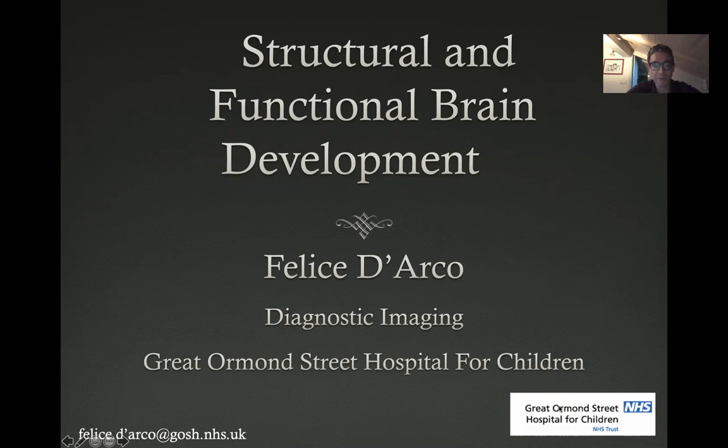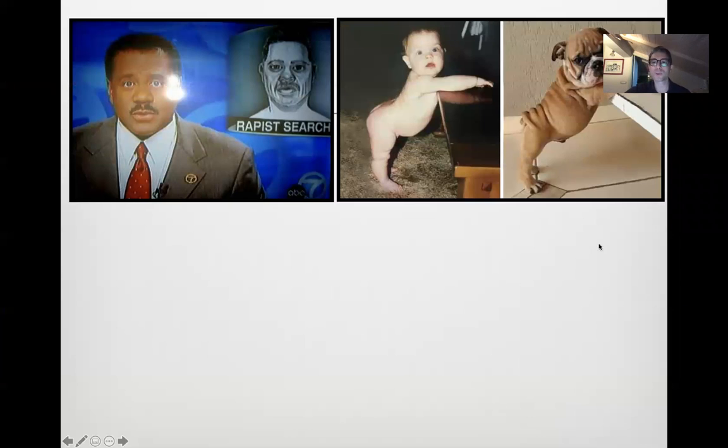Now, a child brain is very interesting because when you have a problem, when you have a disease, a pathology, different pathologies can look very similar. Because the brain really has few ways to react to an insult. So in the developing brain, different things can look very similar. And this is of course a joke, but just to show you how different things can look similar.